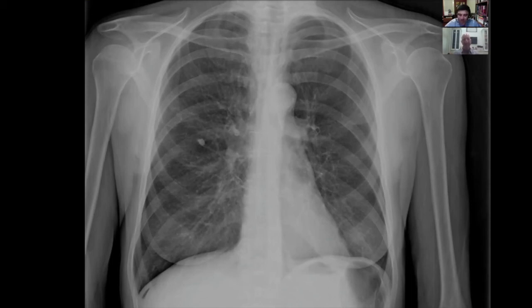No, that's great. And that's the problem. You get some older patients, and a lot of these incidental findings can really be distracting. If you let yourself get sidetracked in some of this miscellaneous stuff, it can cause you to miss out on what's really significant here. This is a patient that had some coughing and abdominal pain, actually.